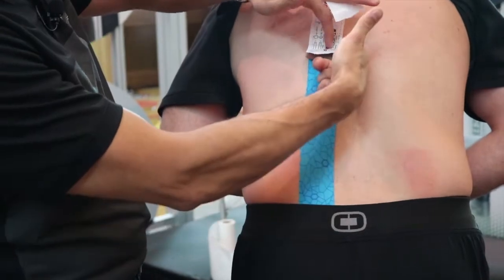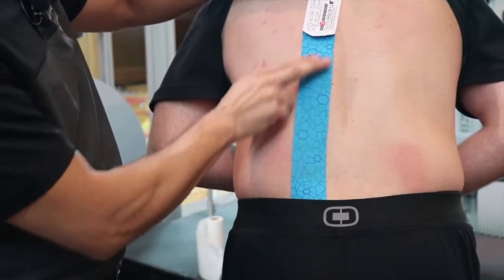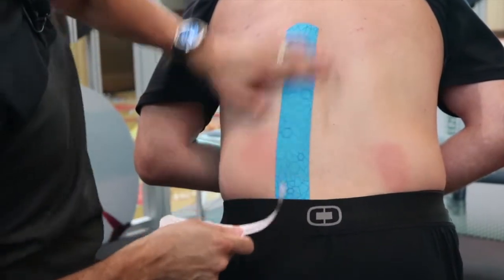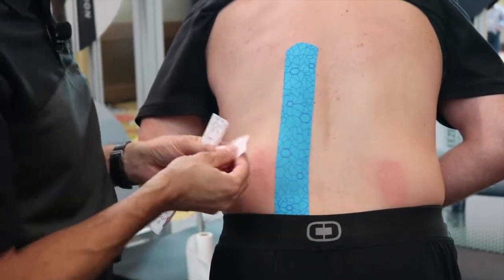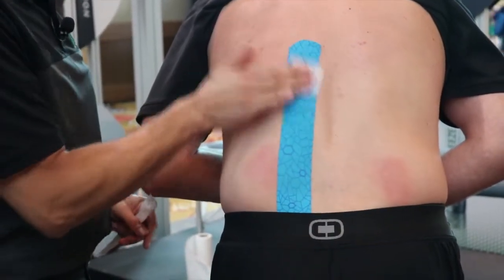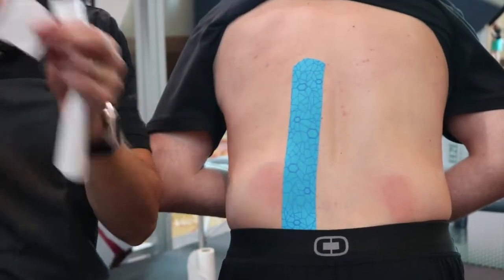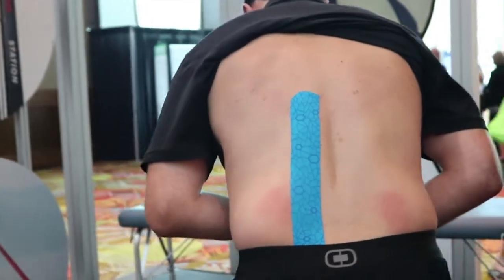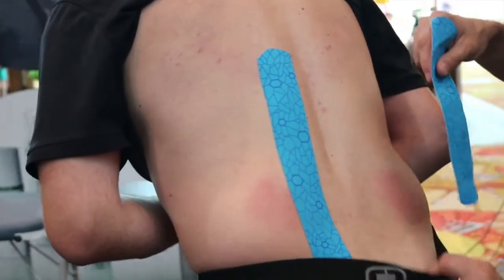You'll see that I put my finger right behind the tape as I'm peeling it off. It keeps it smooth, no wrinkles. And now I'll just peel off the rest of the backing, that last 10%. We'll always rub the tape because it activates the adhesive and have it stick to the skin. When we get to the corners, it's always good to use the backing to rub because of the wax on the back. It won't catch the tape and peel it back off. We're going to do the same exact thing on the right side.